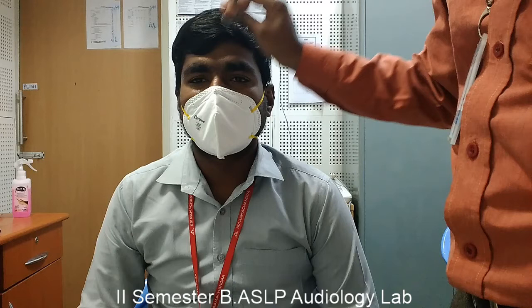If the subject perceives the sound at the center, in the midline, or equally loud in both ears, that indicates the person may have normal hearing, sensorineural hearing loss, or conductive hearing loss of equal degree on both ears. That is why he or she perceives it in the midline or equally loud in both ears.